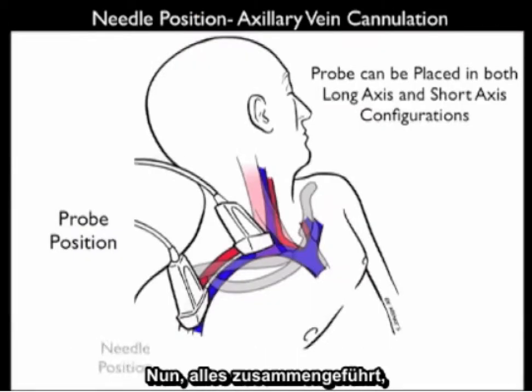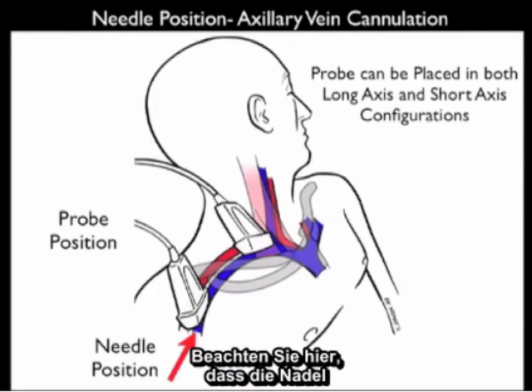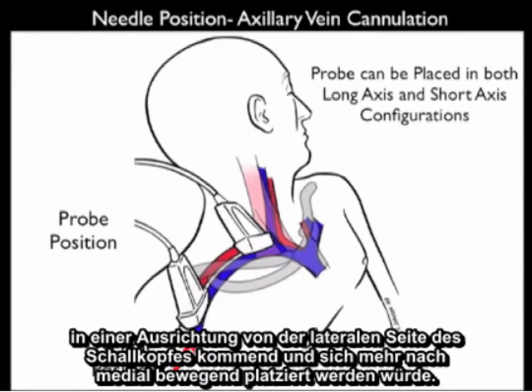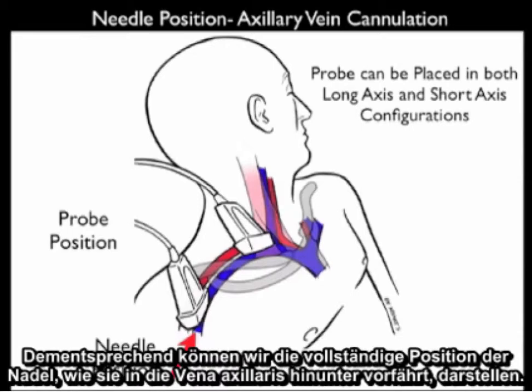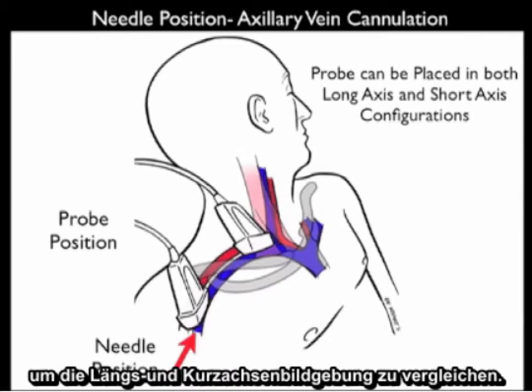Putting it all together — here is the probe position for cannulation of the axillary vein in the long axis orientation. The needle is placed coming in under the lateral aspect of the probe and moving more medially, allowing imaging of the full position of the needle as it moves down to the axillary vein. In the next few images we'll also show the probe placement for short axis cannulation to compare both orientations.